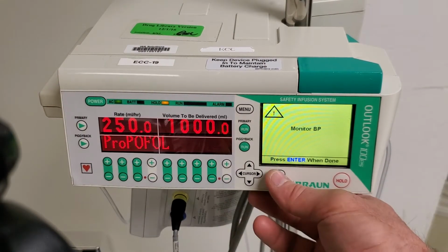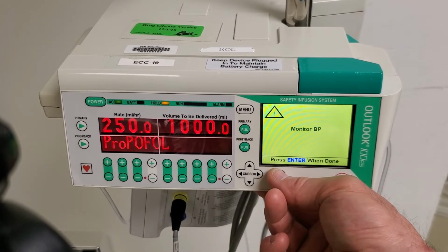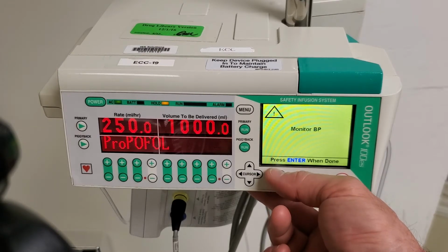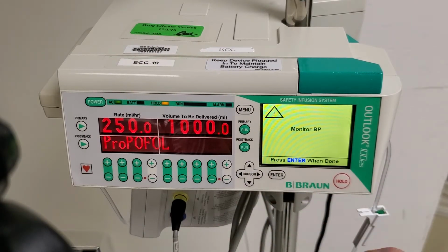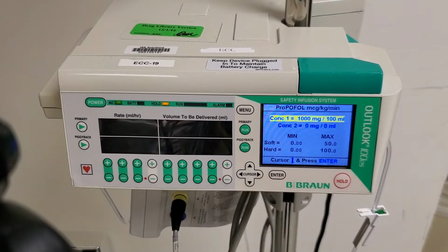Now a warning comes up telling you to monitor blood pressure. If it was a drug like dopamine, it would probably say use caution for extravasation. Other drugs like nitroprusside would have a warning to protect the drug from sunlight. Simply hit enter to get through that warning.